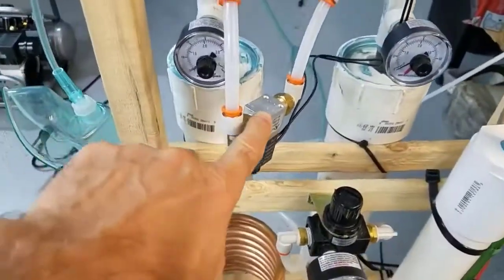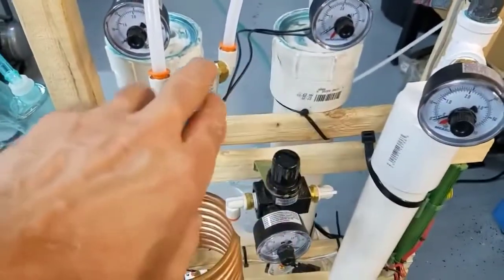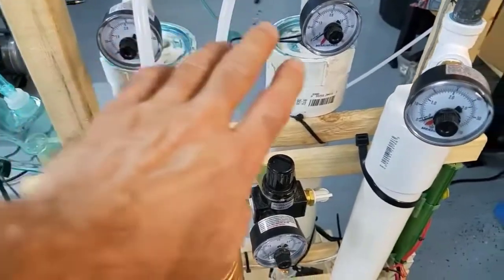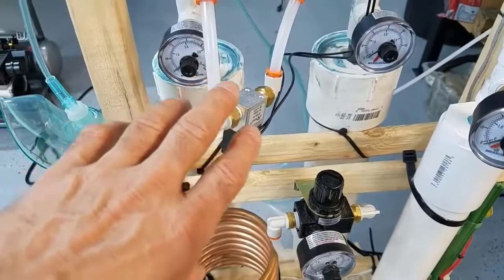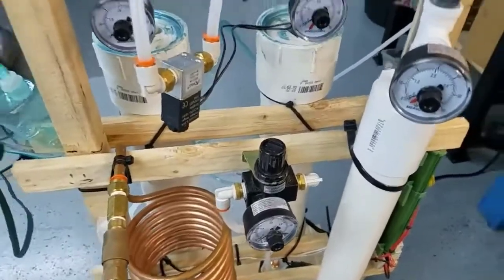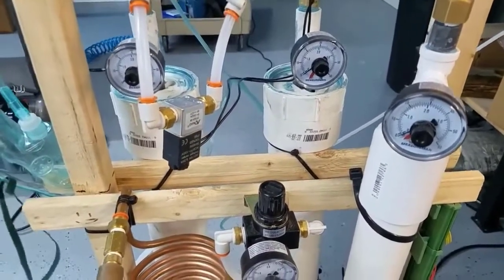This is our equalization valve. What this does is after the sieve is purged, it opens up a little bit to allow the full canister to start to pressurize the empty canister. This way we're utilizing that pressurized oxygen to fill the canister and ramp up the pressure quicker. This helps with nitrogen absorption because the higher the pressure, the more nitrogen is absorbed.